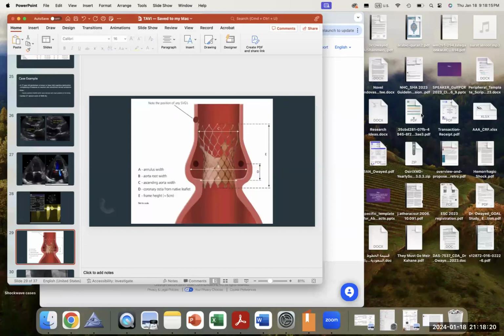Let's push the valve implantation further away, because the valve has a durability of 10 or 15 years. I would like the patient to have this valve at age 66 instead of starting from 65. So it's just pushing the procedure away to have more years of this valve.